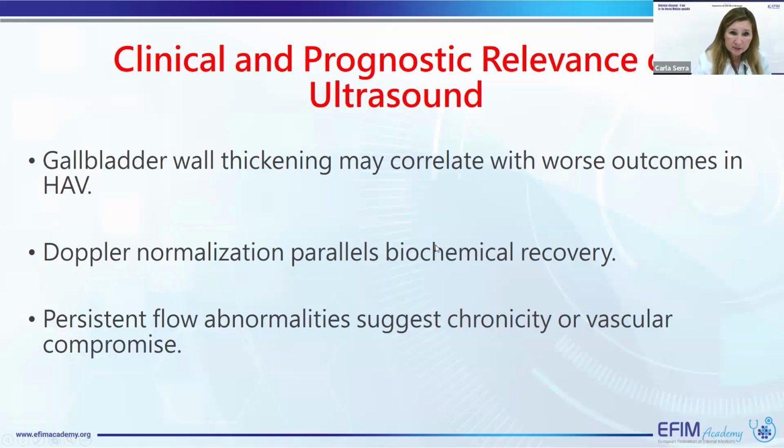So it is important to use ultrasound not only at the beginning of the evaluation of your patients, but also during the follow-up.